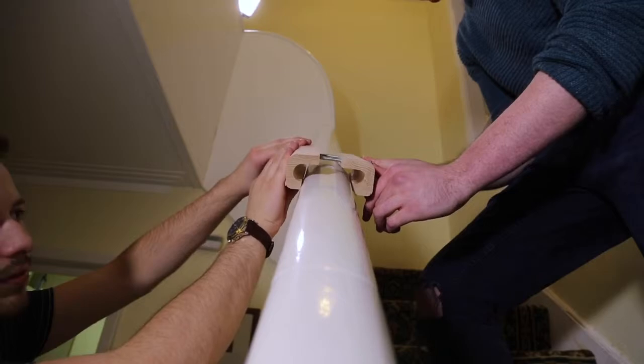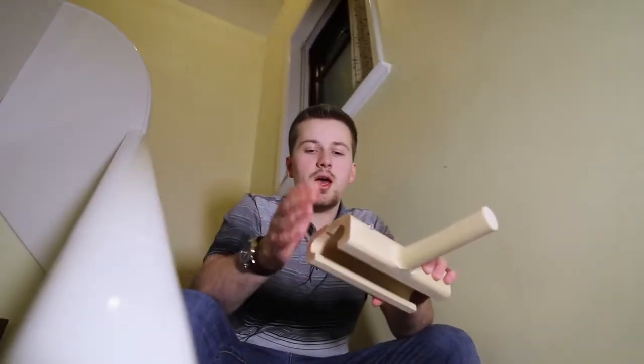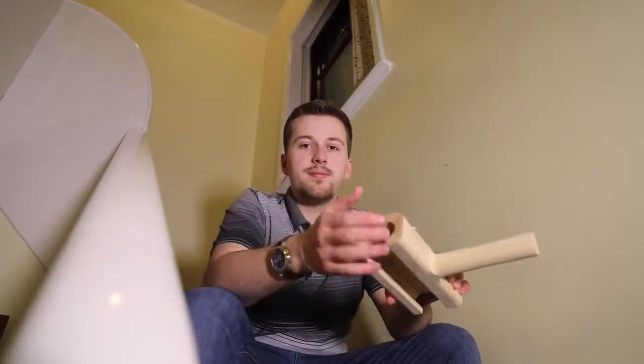Our mock-up banister was not a perfect replica of this banister — this one has a slight curve to it. So we're going to have to add a slight curve to this, as well as take a little bit off the corners here so that it can slide up more easily.